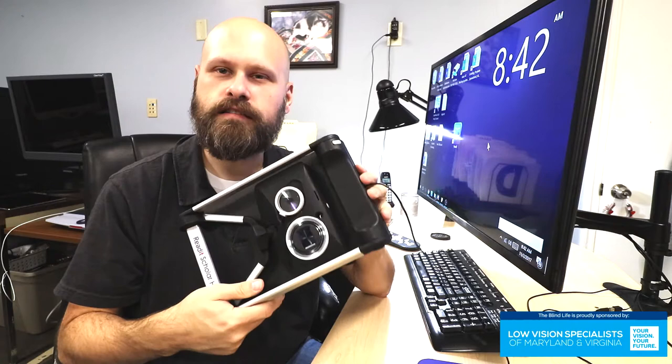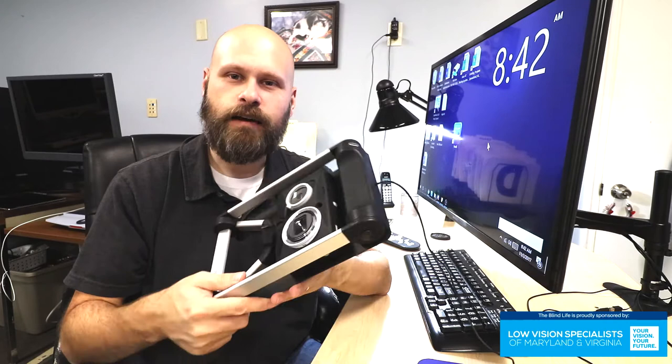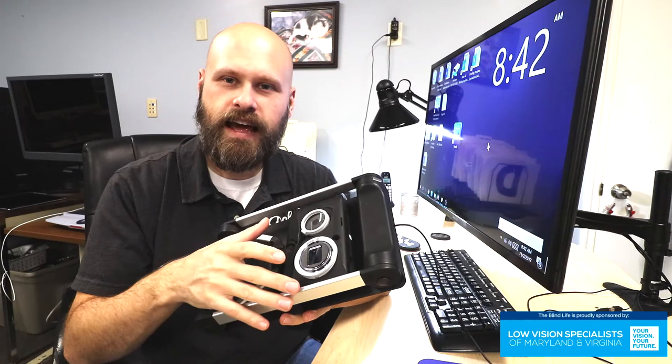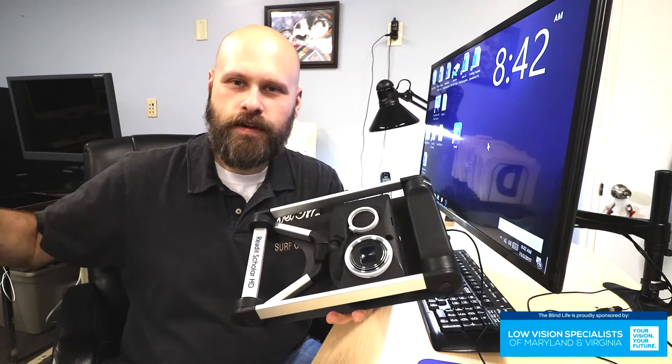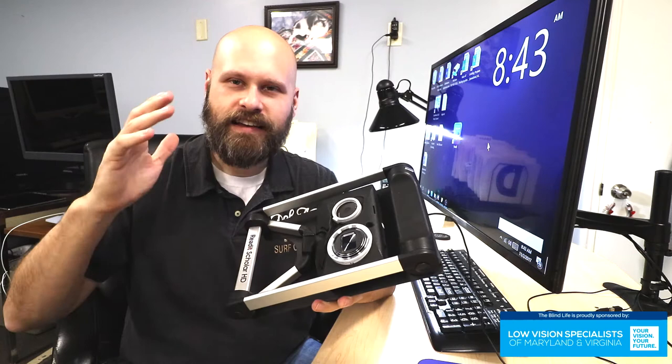All of those features are standard on this device. But what makes this special is that it also does OCR. So you'll be able to capture an image of a document and it will read it aloud to you. It's got a very powerful OCR camera built in. One of the extra benefits is that it can do OCR at a distance — it can take a picture of a newspaper at 20 or 30 feet away and OCR that newspaper. It's got a powerful camera and can OCR font sizes all the way down to four point font.